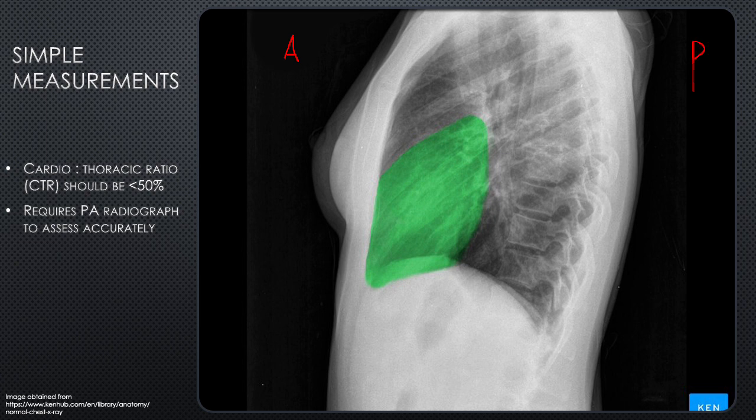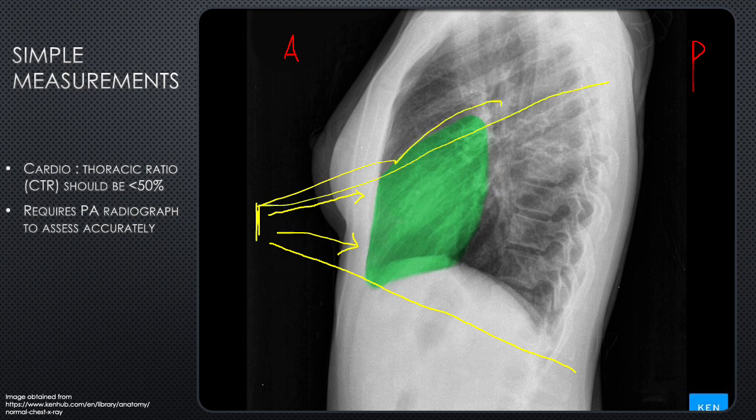And so if you've got an image projector, you've got your x-ray machine here, and you're sending out rays which are going in this sort of direction, and again like this. These rays are going to cast a shadow like so on the back of the actual board that's capturing the image.